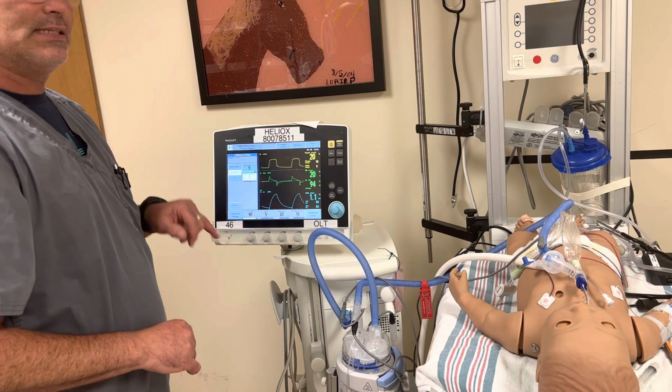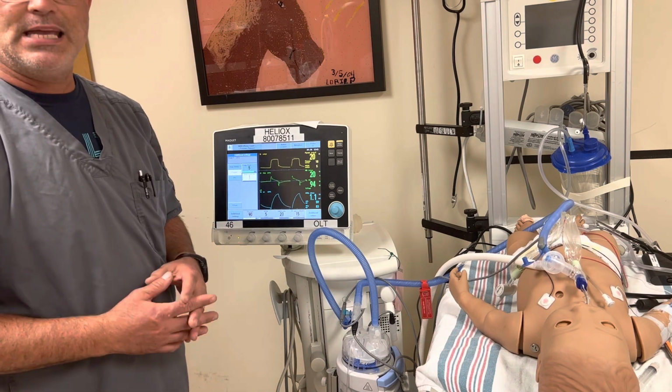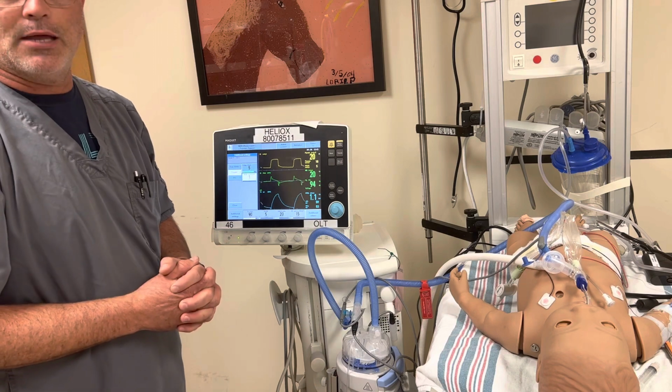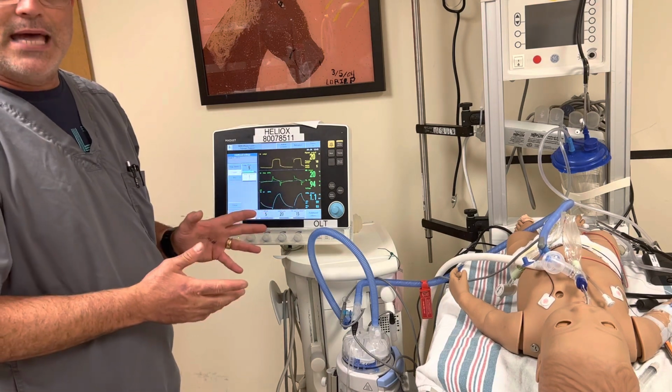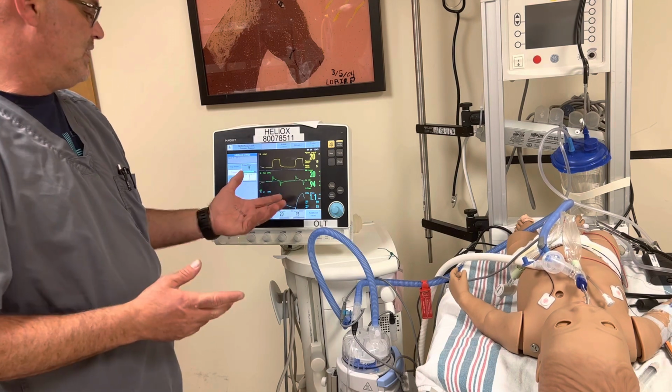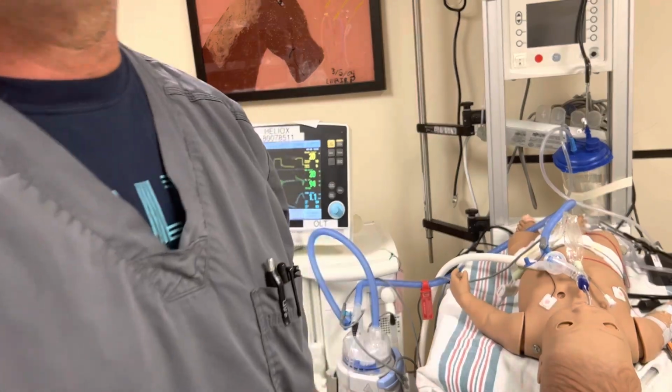We want this to be at 1% as much as we possibly can, right? Well, if 1% is the answer for everything, why is it even settable? Why doesn't the vent just default at 1%? Well, the reason it doesn't default at 1% is because leaks cause a problem.